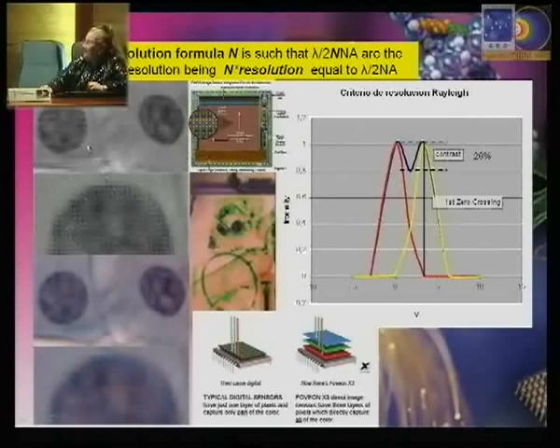So what you are looking at here is a raw image. The classical raw image that you get on the cameras is this type of image, that obviously in order to see in color, you have to combine the information regarding red, blue, and green. And this is the combined image of that one. As we will see immediately, the spatial resolution is lost because you combine some of the information. This is what happens with a single chip camera, which is sensitive to the three colors.